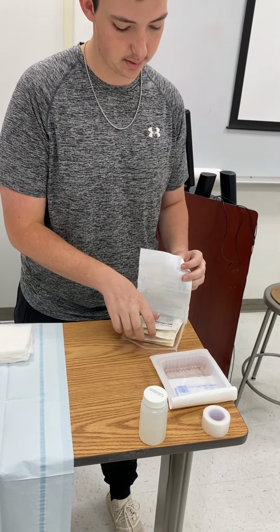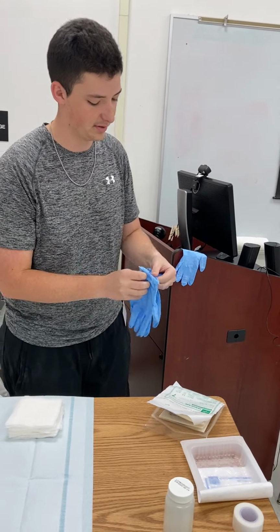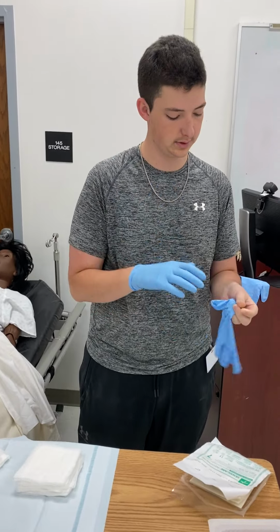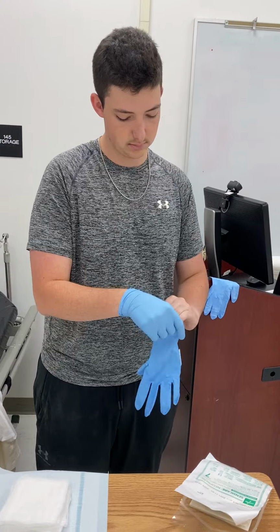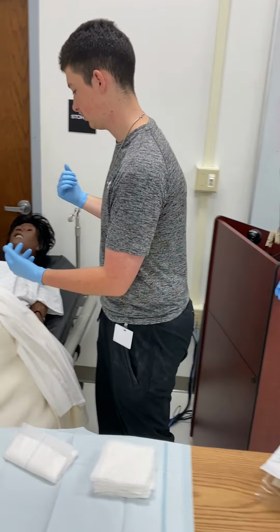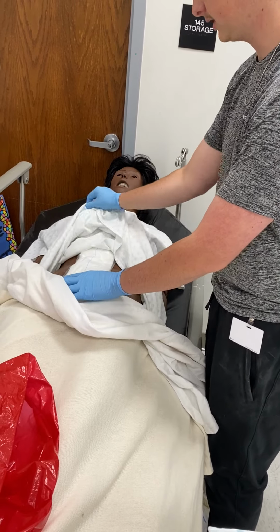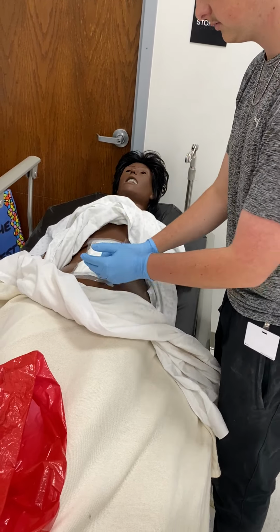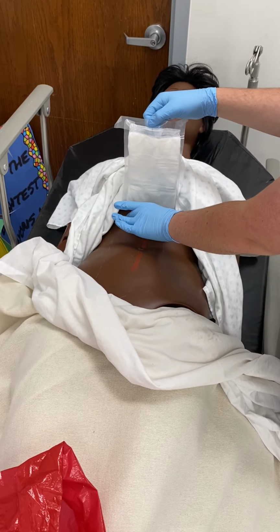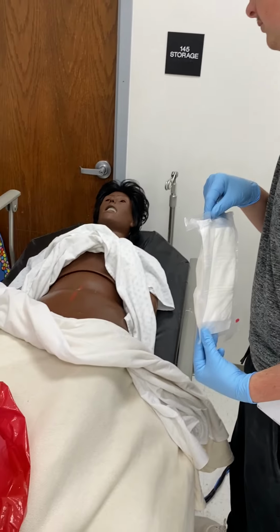I will be donning my clean gloves, not my sterile gloves just yet. Make sure I'm over the sterile field. All right, now I'll be removing our sterile dressing, our contaminated dressing. Okay. Careful to not injure the patient. All right, now I'm checking for the color of the drainage and the characteristics of the wound.